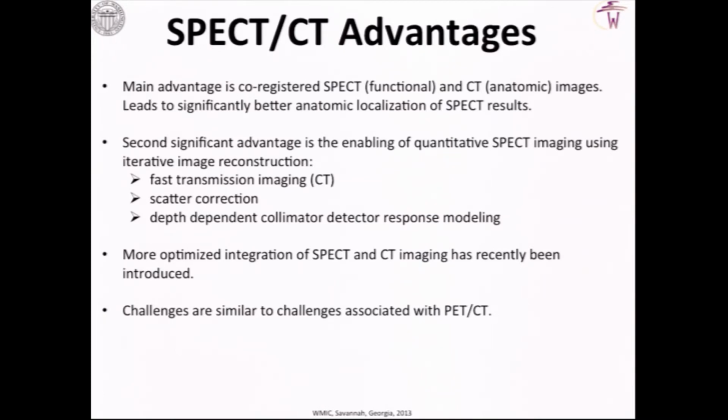There's recently been introduced a more optimized integration of SPECT and CT imaging, doing the SPECT reconstruction in the CT image space. I'm not going to show an image on that, but there are some very interesting things going on in that area for the clinical systems. Otherwise, the challenges are similar to the challenges associated with PET/CT.